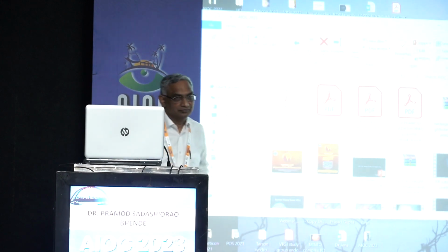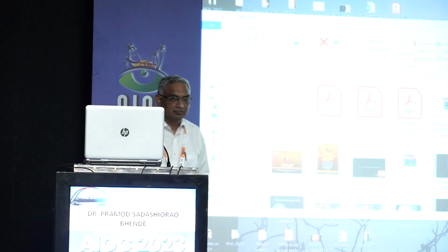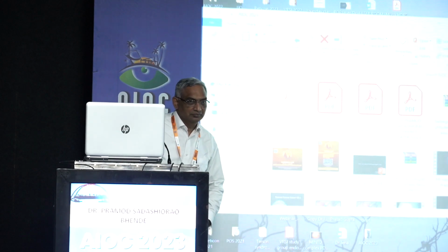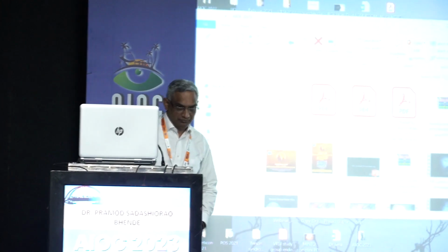So I did a 360 barrage laser in both her eyes. One eye is doing fine, but the other eye, which had less myopia, she developed a retinal detachment. First, I tried a pneumatic. I put in gas and I did more laser. It stayed for some time. Then again, she had a recurrence because there was a contraction at a particular point.